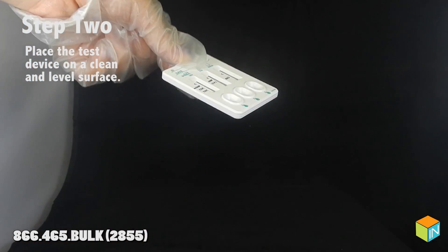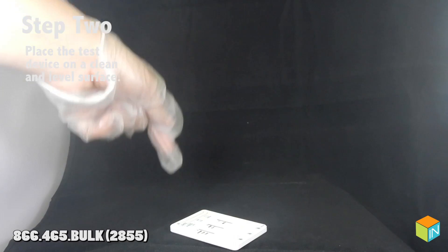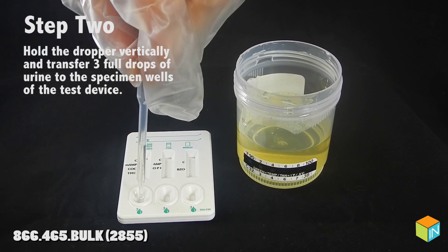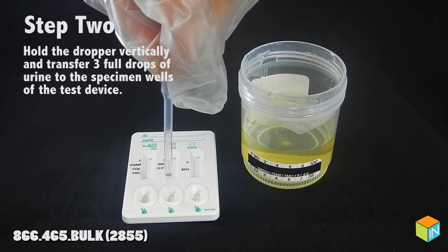Step 2: Place the test device on a clean and level surface. Hold the dropper vertically and transfer 3 full drops of urine to the specimen wells of the test device.